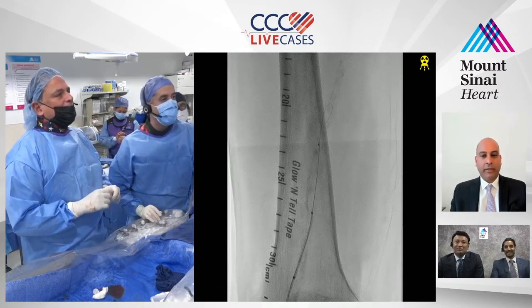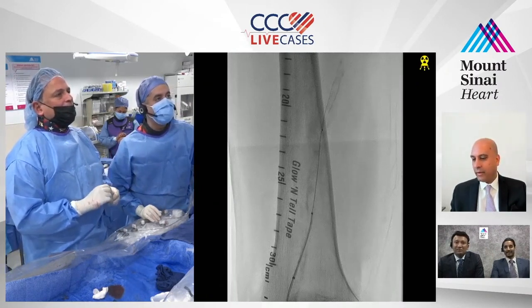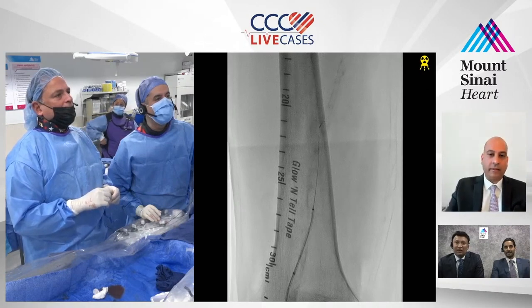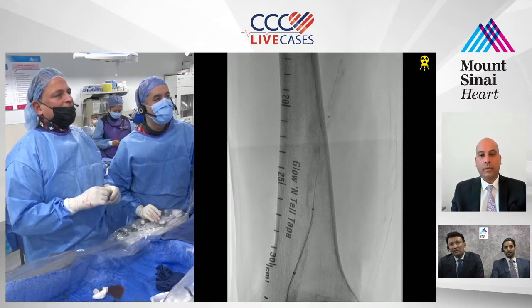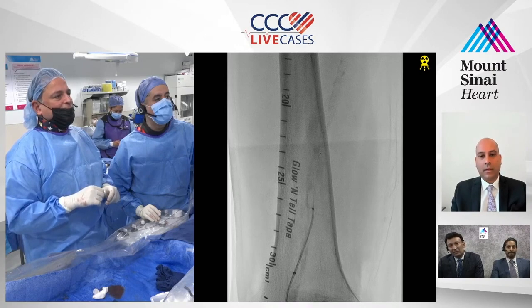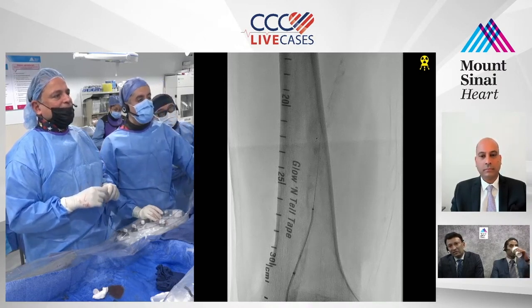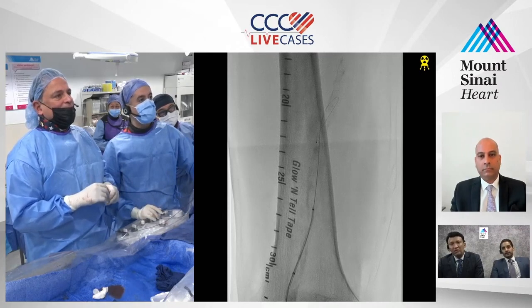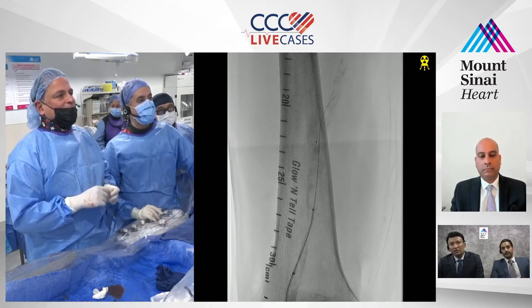So at this point, would we use a CTO wire, PK? You're still outside. We're still on the plane. I think we're going to go with the CTO wire now. With this wire, it's pretty good in the sense that it'll try to find these planes. It spirals around. It doesn't look like it's going to go. The loop is quite large.